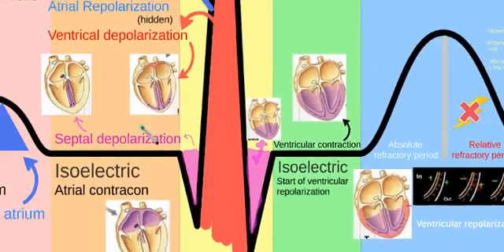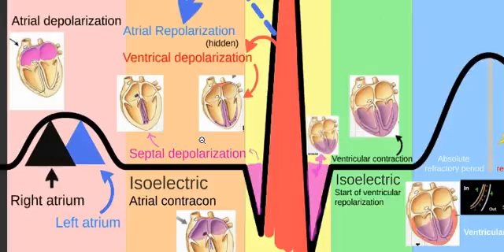Now, this QRS wave has some special things that are really important to understand. Firstly, is that we hit this Q wave, and this Q wave, this physiological and sometimes pathological Q wave, is important in interpretation because remember I said it starts from the left side of the septum of the myocardium and then diffuses outwards through the Purkinje fibers, but it first hits that left side and then moves through that. And if we have a lot of scar tissue through damage, it could actually be elongated to like out here because it's having a hard time passing through that muscle cell.